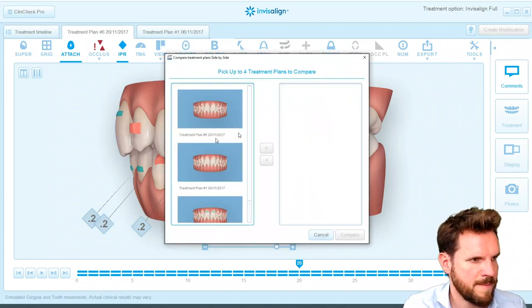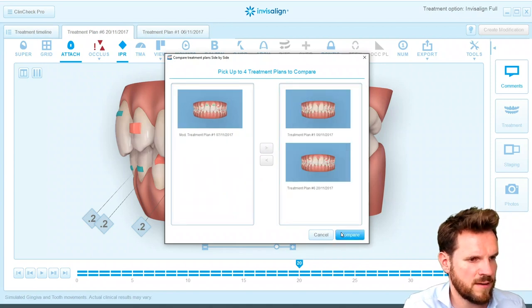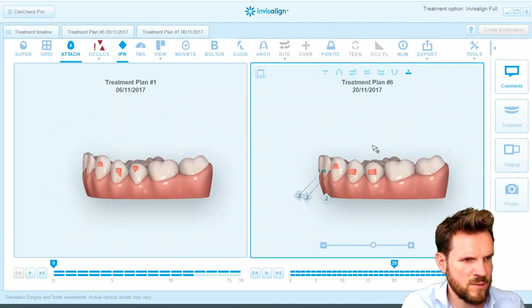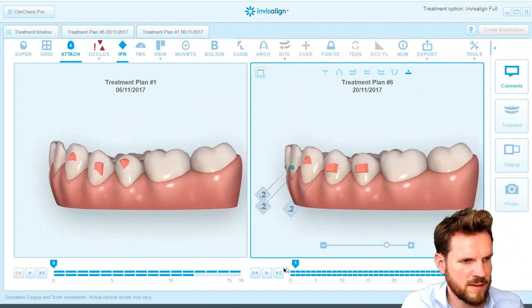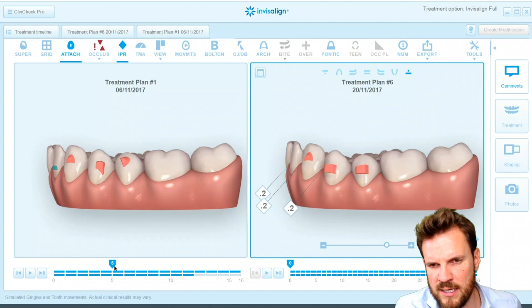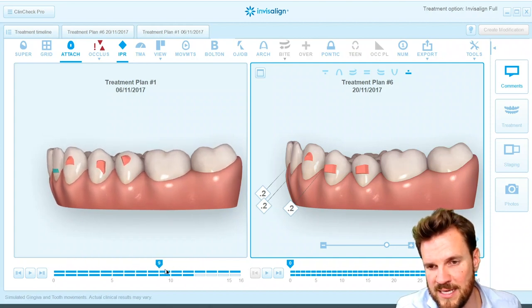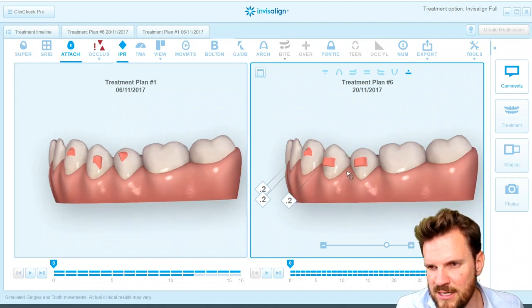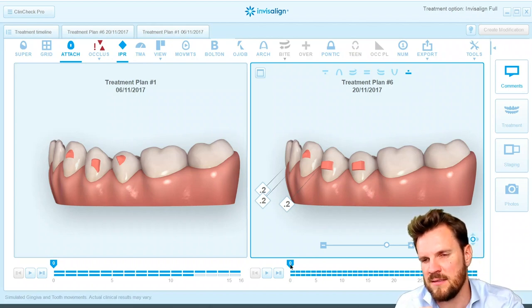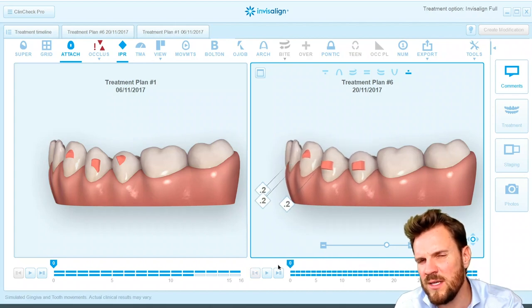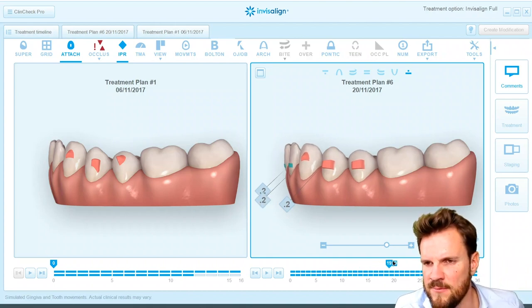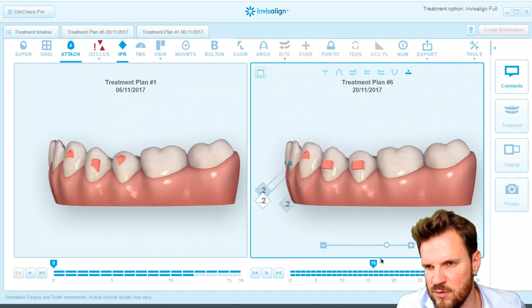Now if we compare both plans — the first clean check and the clean check approved by the doctor — you need to understand that the most important part was to really get out of the deep bite situation, especially in the lower arch. On the left side you see the first clean check with root uprighting movement and all these difficult movements, and only 12 aligners for lower anterior intrusion. It's much better if you decide not to move the molars in this particular case.